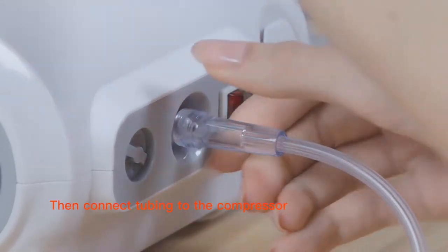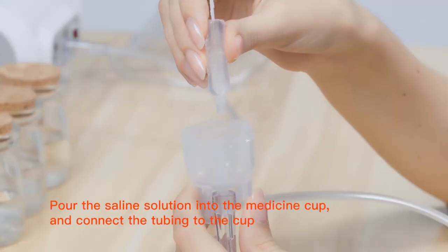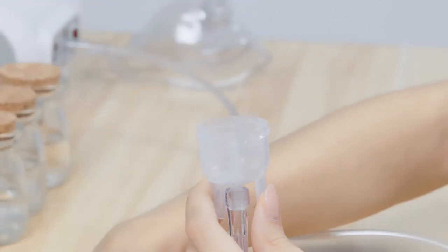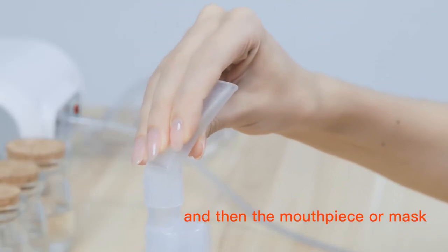Connect the tubing to the compressor. Open the medicine cup and pour the saline solution into it, then connect the tubing to the cup. Attach the top piece to the medicine cup and then the mouthpiece or mask.